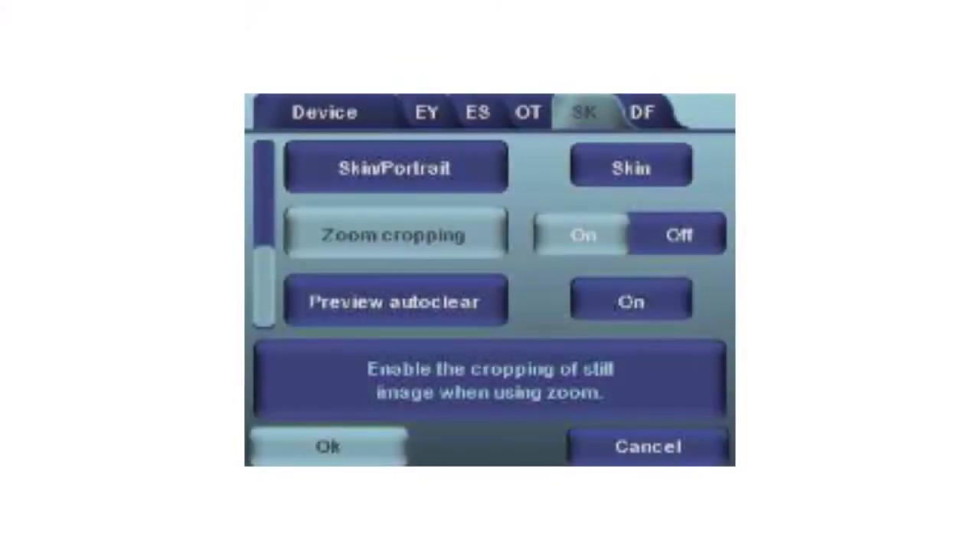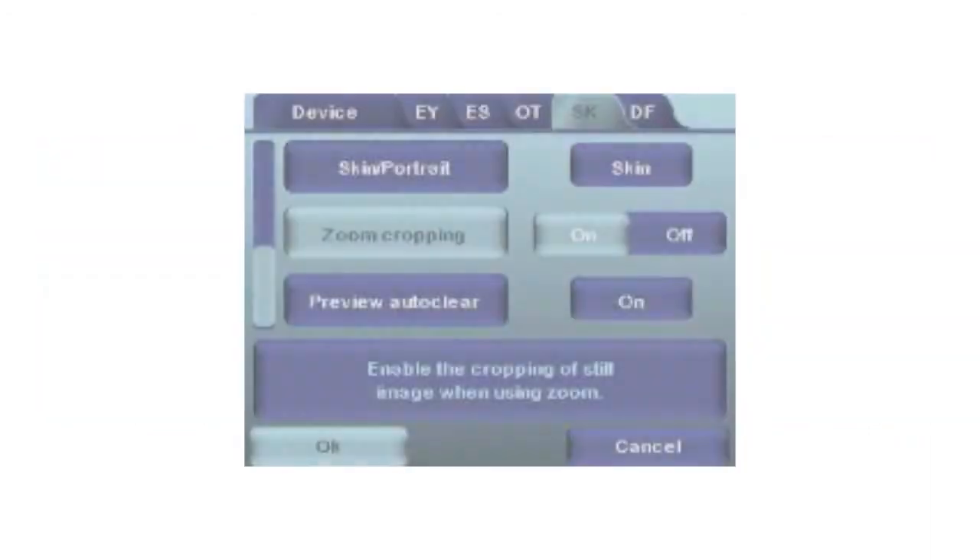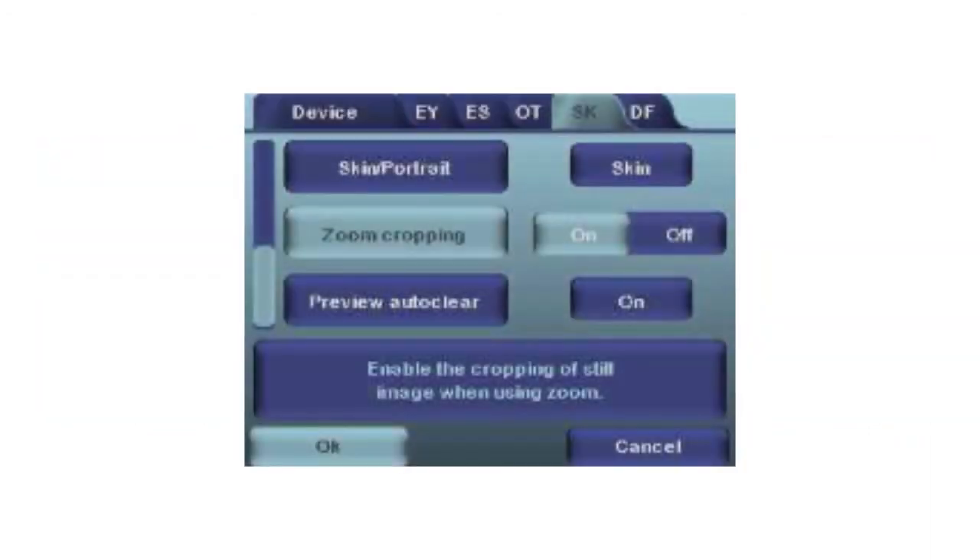Zoom cropping: when zoom cropping is enabled, the camera will save the zoomed area instead of the whole image area. By default, zoom cropping is always turned off and the camera will save the whole image area instead of the area that is visible on the screen when the user has zoomed in.